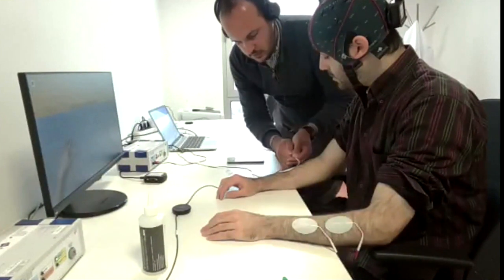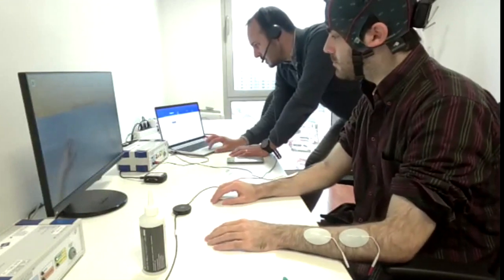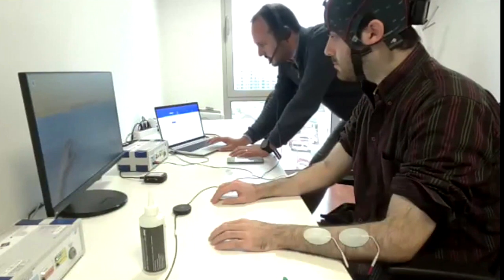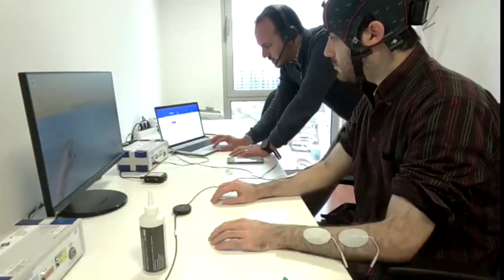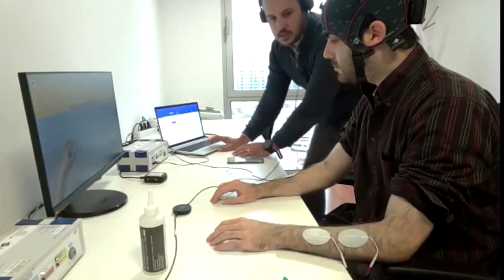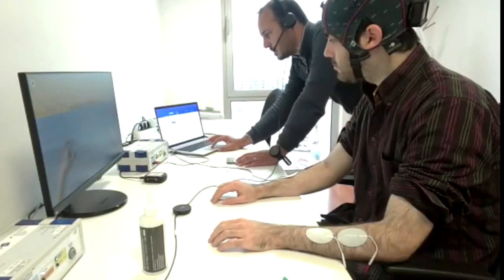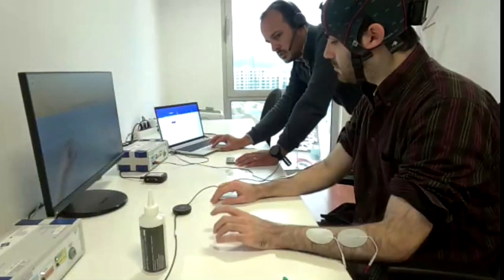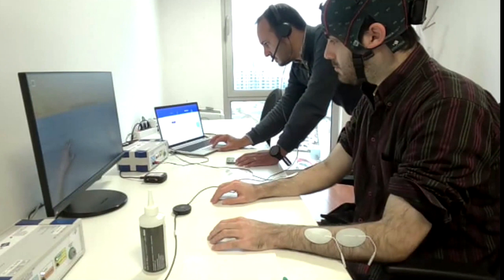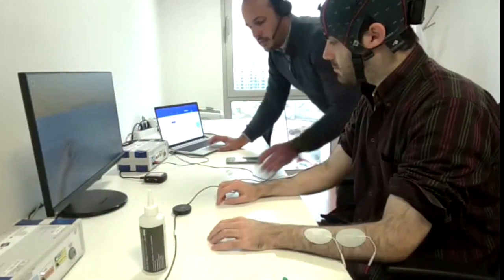So once the electrodes are connected, we can start calibrating the stimulation on the therapist computer. We always start on the healthy side. Let's imagine that the healthy side in this case is the left side. So we start the stimulation and we can increase the current slightly until he shows this extension of the fingers, okay? In case the electrodes are not correctly placed, we can readjust them, right? Until we see clearly this movement, okay? We do the same on the right side. So here, for example, we have 9 milliamperes in each hand.